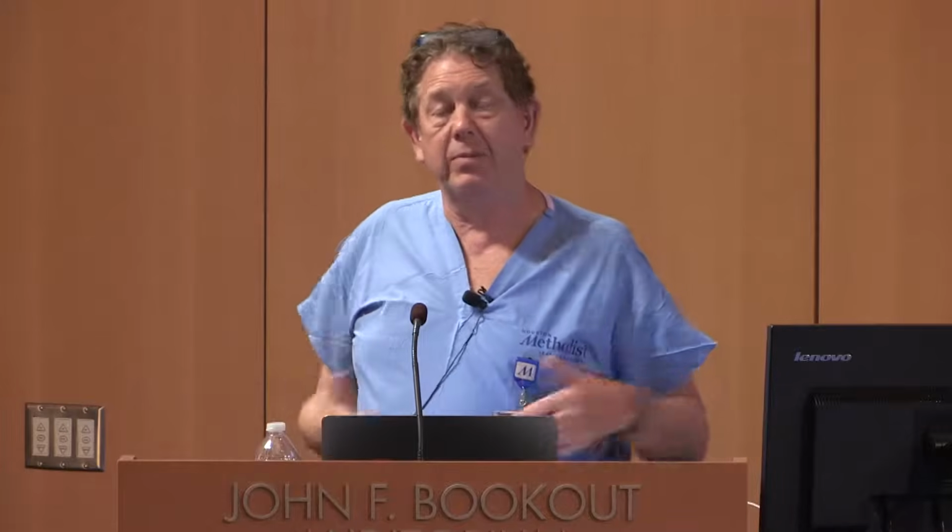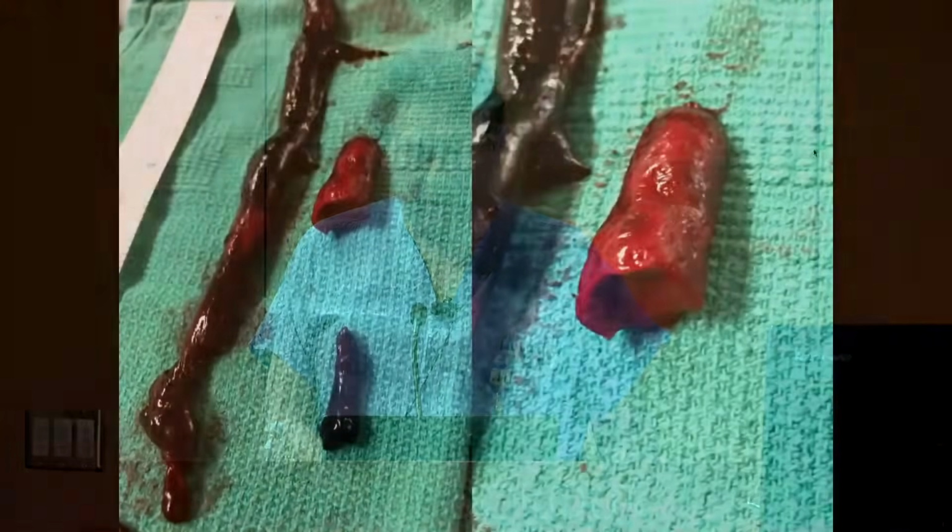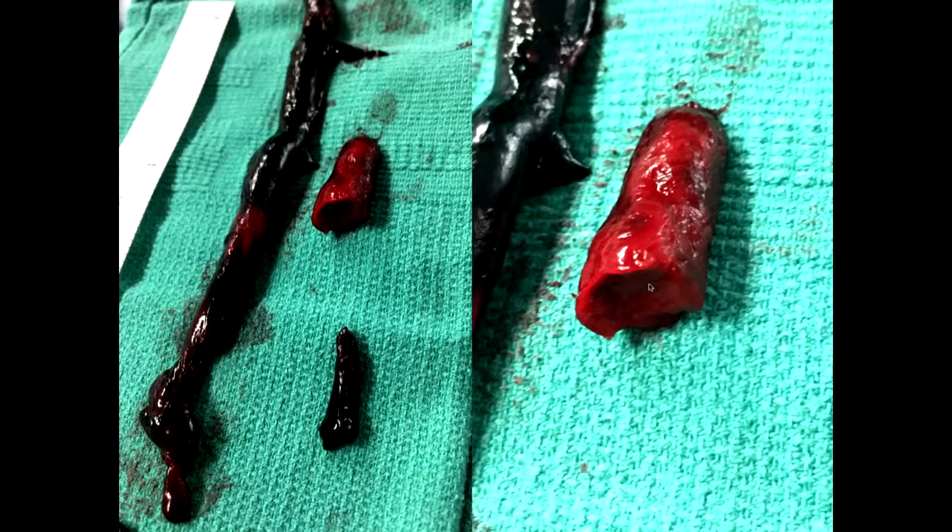And there are over-the-wire Fogartys, which are essentially using endovascular techniques, and sometimes we use them intraoperatively, and you pass the catheter beyond the thrombus, you blow up the balloon, and you essentially pull it back. And what you're looking for is, we're always looking for what we call the plug. So anybody know what's going on here?